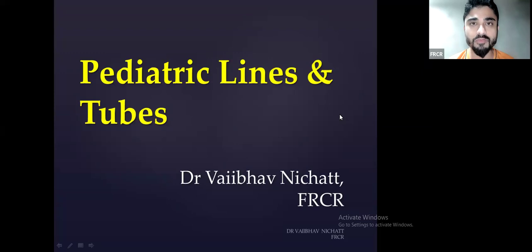So we are done with adult lines and tubes. Now we will be moving to pediatric lines and tubes. I have divided this session into two parts. We will be discussing a few lines and tubes in session one and the rest of the lines and tubes in session two. Okay. So without waiting, I think we should start with the session.